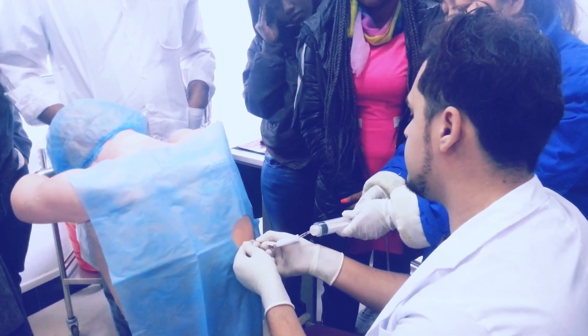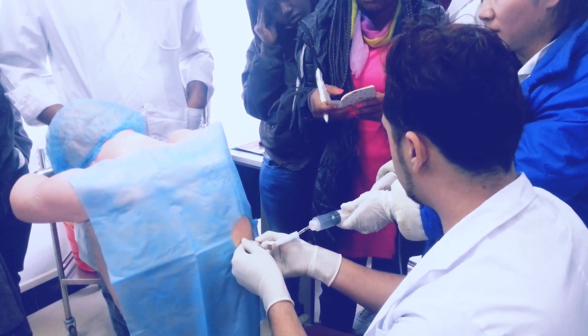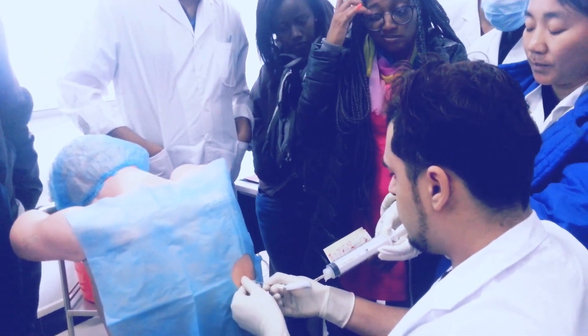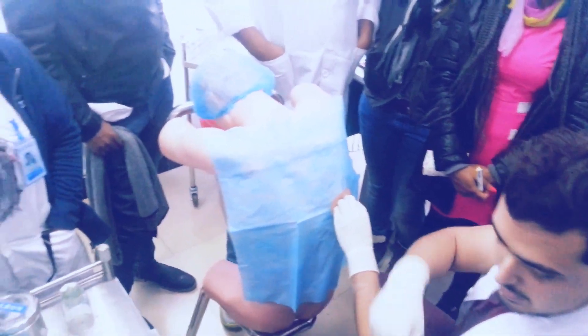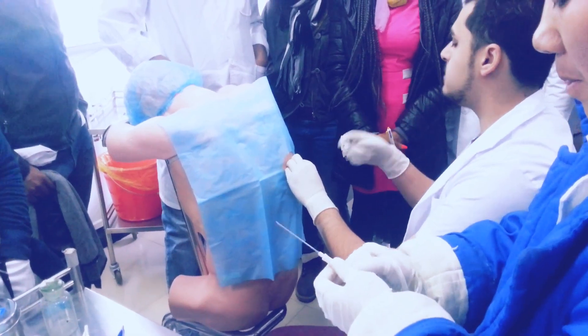Or it will lead to lung collapse, pulmonary edema, and many complications. And for sampling — if we are taking it to determine whether it is just pleural effusion or if the patient has some cancer — we will collect it and the assistant will prepare the slides and send them to the laboratory.